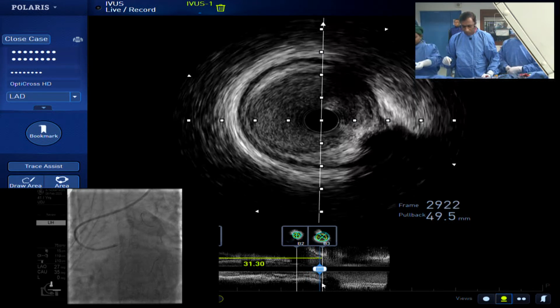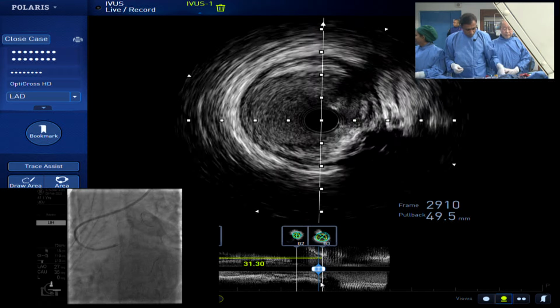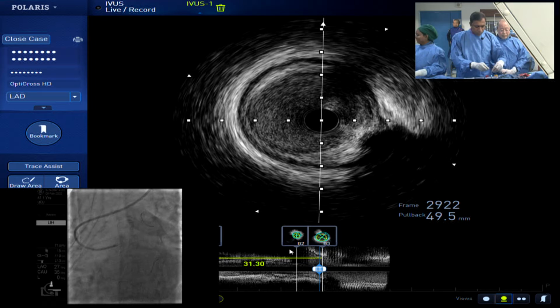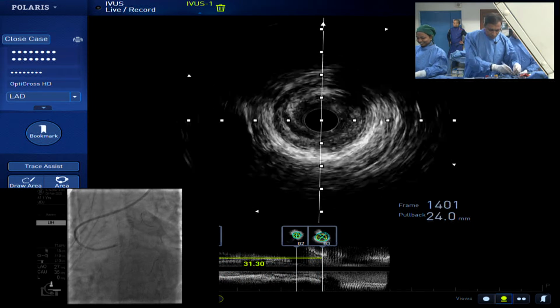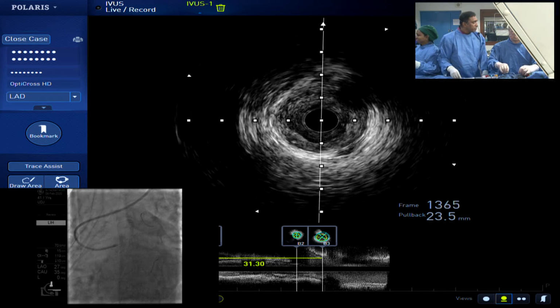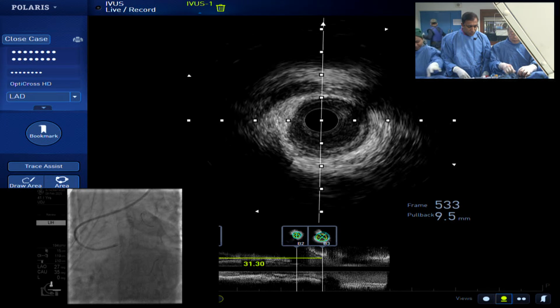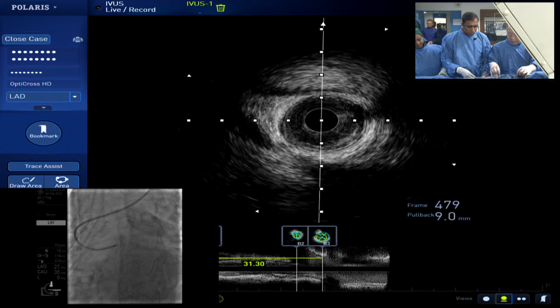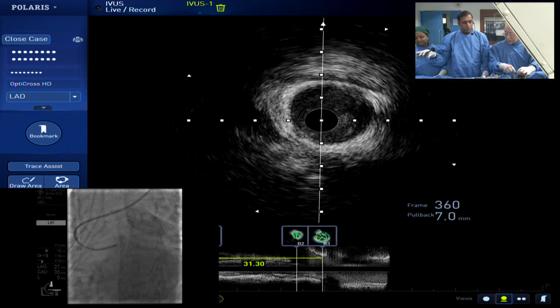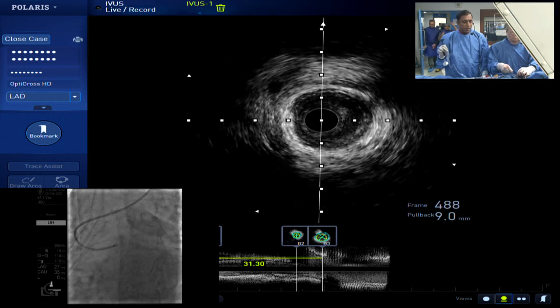So do you think, if we get a good result here in the proximal LAD, that in time, with the passage of time and better flow, the mid and distal LAD is going to be a bigger vessel? After a time? More distally. So this is a POT balloon, 3.5 by 8.